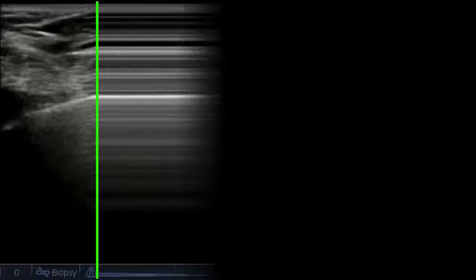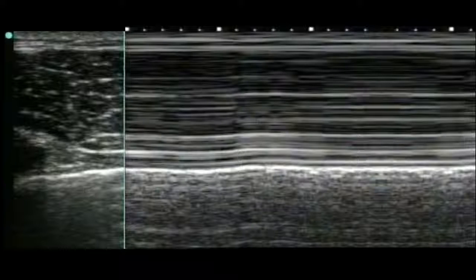You drop the M-mode spike through the pleura, and everything along that M-mode spike is plotted over time. So you see that single line plotted over time on the x-axis. The chest wall, which is not moving, appears as straight lines as there's very little to no movement, whereas the lung and the pleural line, which has a lot of movement and artifacts, shows this textured appearance over time. This is called the seashore sign, as it looks like there is beach and water.